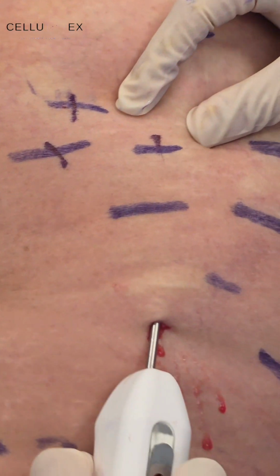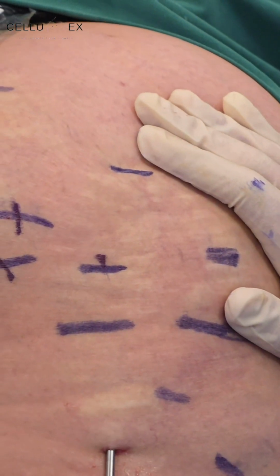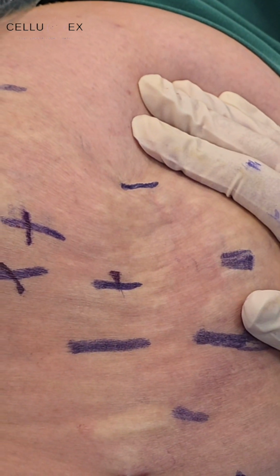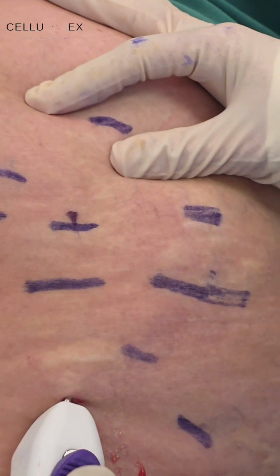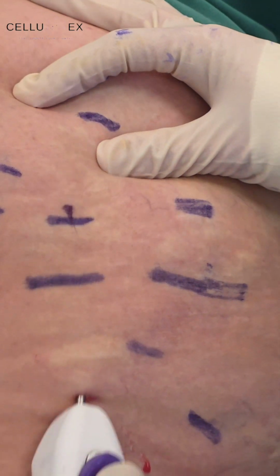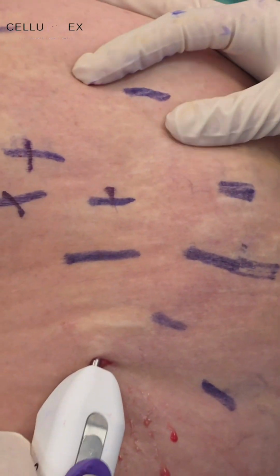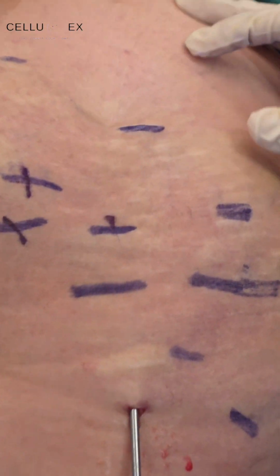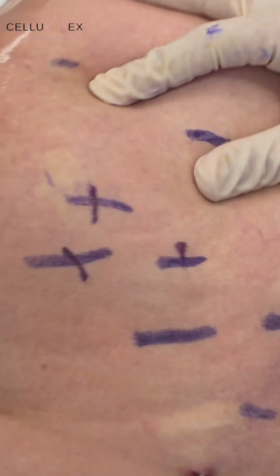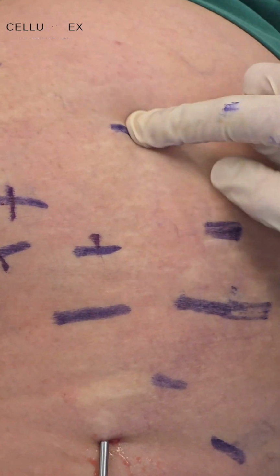And with the light source here, you've reached here. So it is tethering the skin. Press one time, hold the septum, second time, you try, so see how hard it is. This is a controlled septal release and targeted toward the septum causing the tethering. Here still, it is not fully released. Now I have to check that it is fully released. Yes, it is already done.